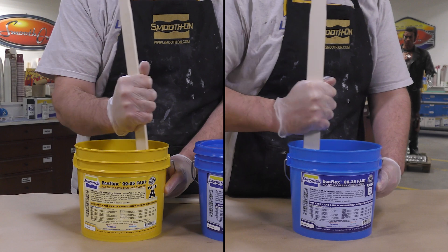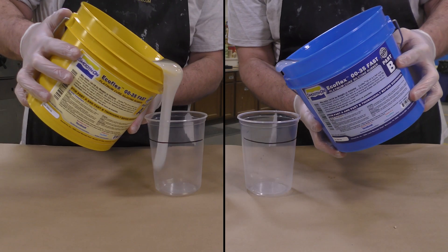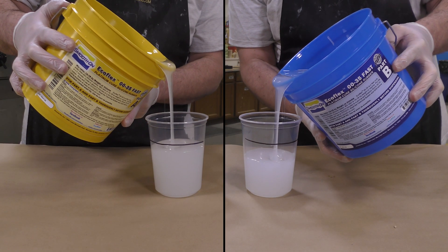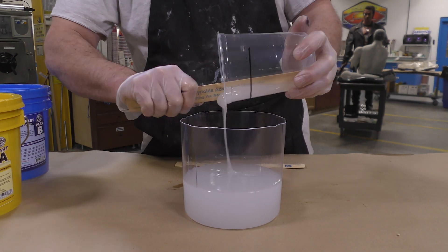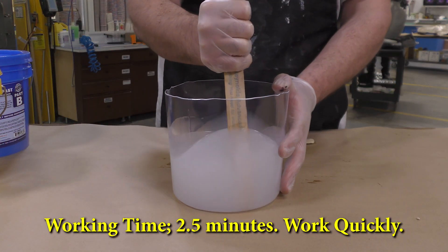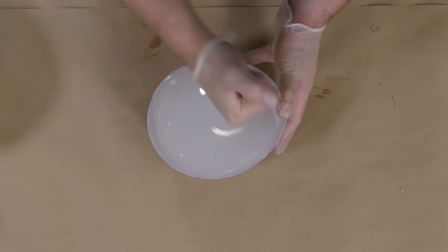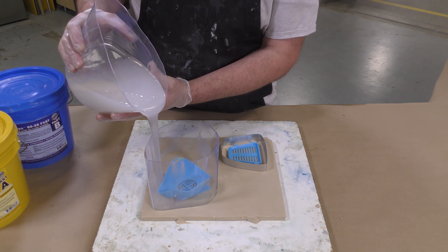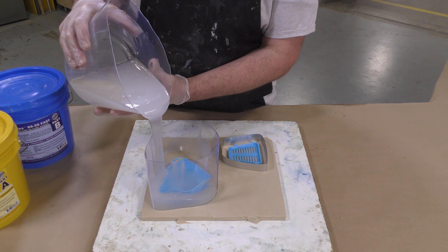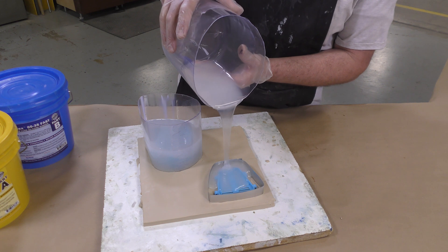Go ahead and dispense the material, then combine it into a clean mixing container and mix it thoroughly. Scrape the sides and scrape the bottom — work fast but thoroughly. Once you have the material mixed, get it quickly into your mold box. Pour at the lowest level of the mold box and let the material find its own level. It will push away any air bubbles from the model surface and won't trap them on your mold surface.